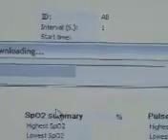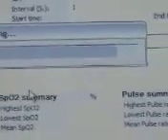So then you'll go over here to the download icon. And then it starts downloading. It'll take probably 10 seconds or so. I'm going to set someone else up there to show that. Good point. There's instructions too under help. If you can just open the help on that, it'll show you all this process.